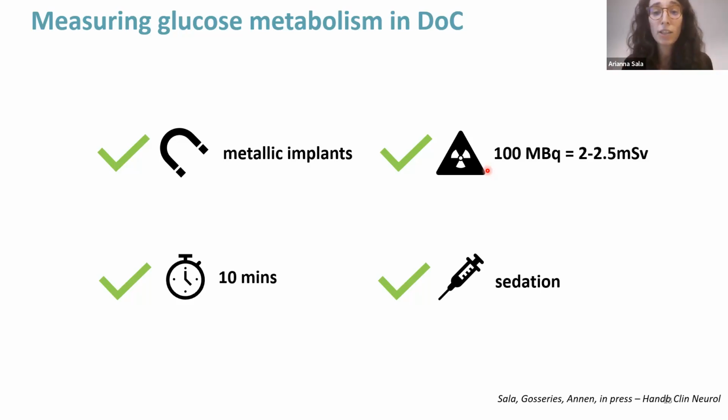We can keep the patient under control, make sure he's awake, under control conditions, and only after 30 minutes we put him in the scanner. After 30 minutes, the uptake of the tracer has reached a plateau, so we can apply sedation without affecting the results of the exam in a significant way.